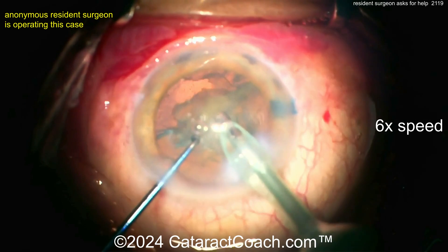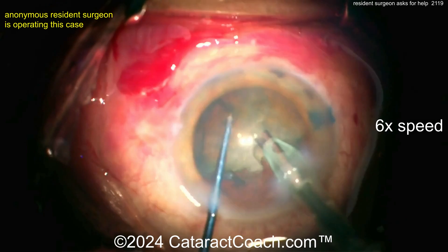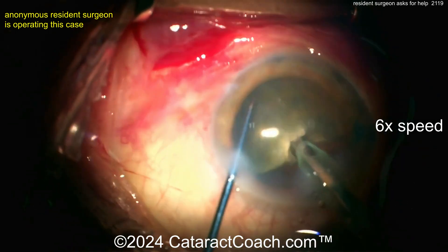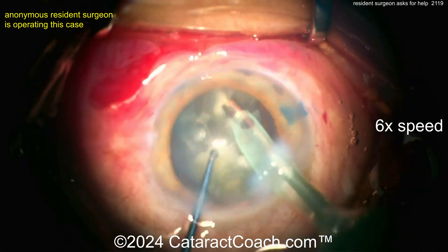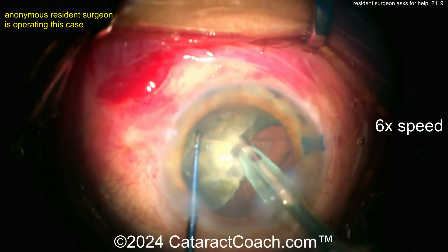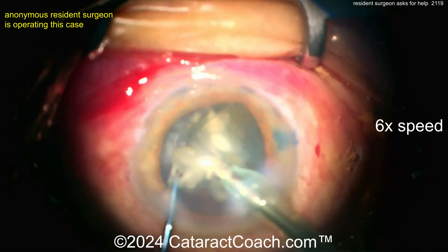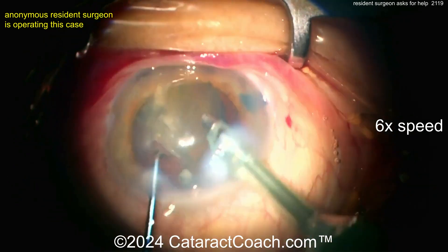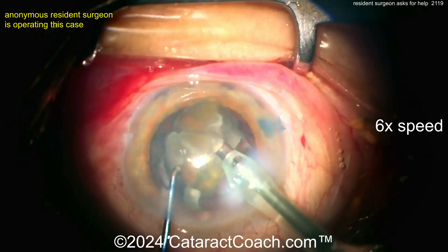We have videos telling you how to keep the eye in primary. Now finally the eye is back in primary — is it going to stay that way? That weird jiggling thing you're doing, what are you doing? Take your time. You need to focus on the basics — get back to basics. Don't worry about chopping. And now what's all the subconjunctival hemorrhage there? There's a lot of bleeding going on. And look at the incision now — you can see it's too anterior. Look at all the corneal hydration you're getting.